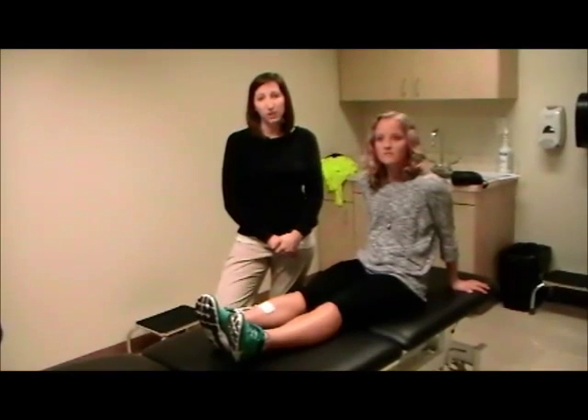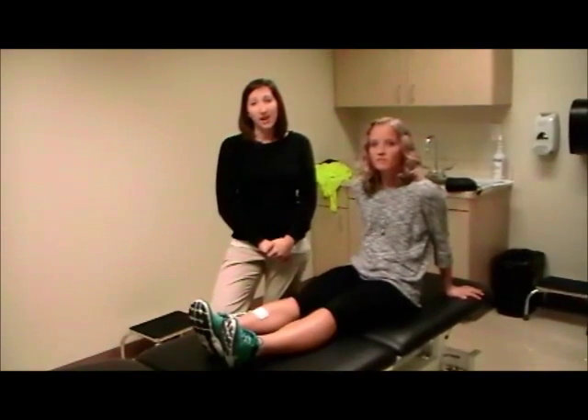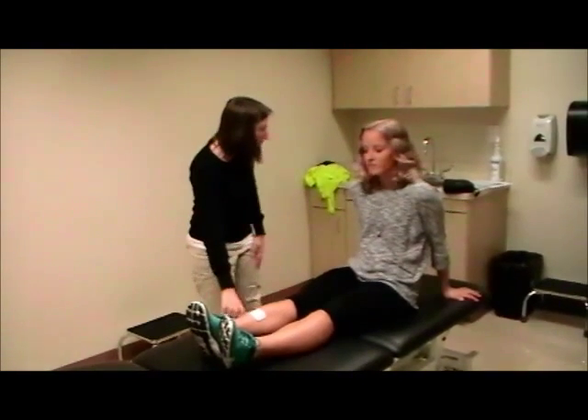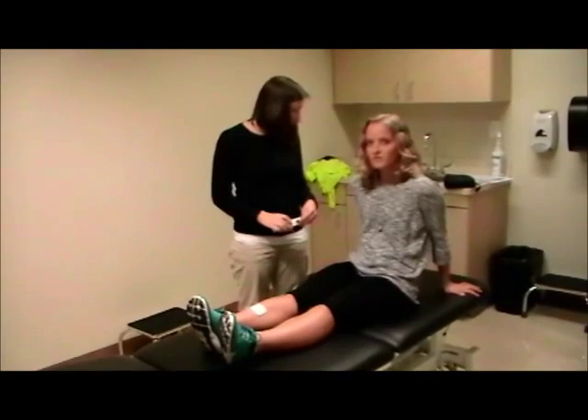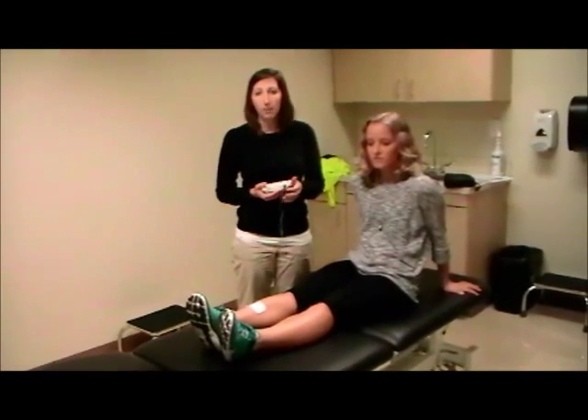I see a lot of patients post-stroke, both chronic and acutely. So today we're going to learn a little bit about cyclic NMES in the use of post-stroke patients. Cyclic NMES can be used to facilitate motor learning post-stroke in a paretic limb. We're going to be working on dorsiflexion weakness with cyclic NMES today.